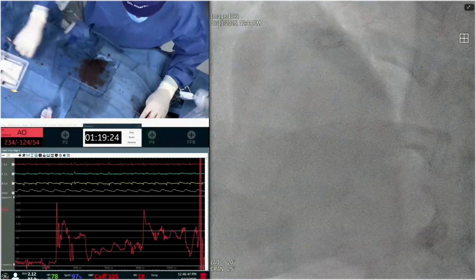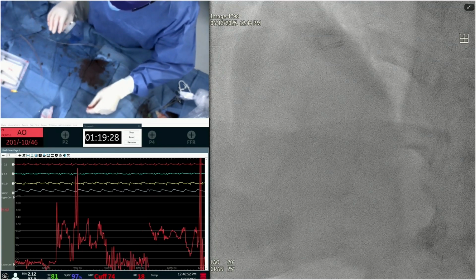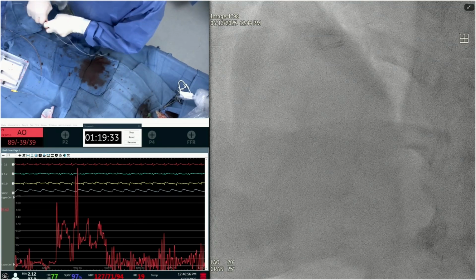Please get a new balloon, get a new wire. But we need to go to our guidelines and come right back to you, okay? Then we will come back to both of you. All right, excellent, wonderful. Thank you, Dr. Sharma.